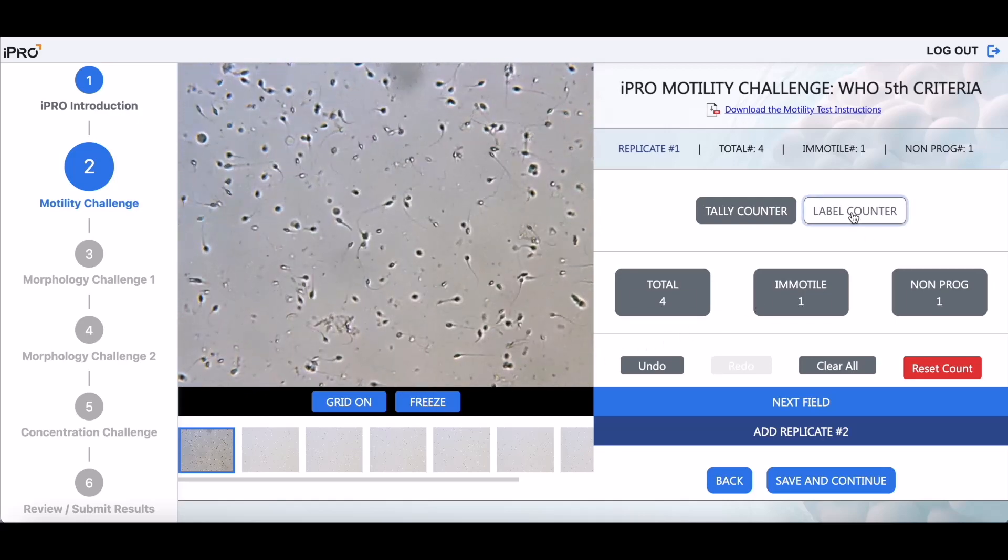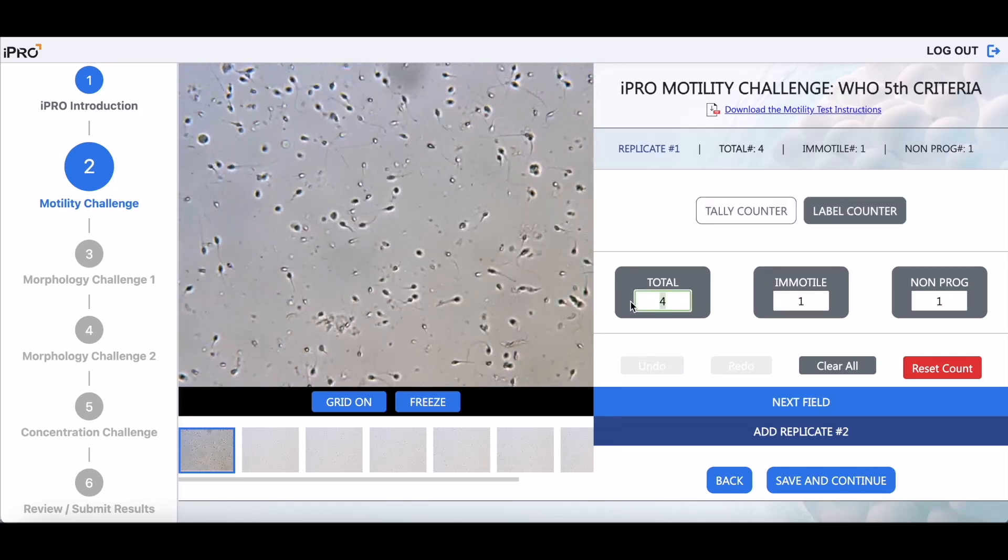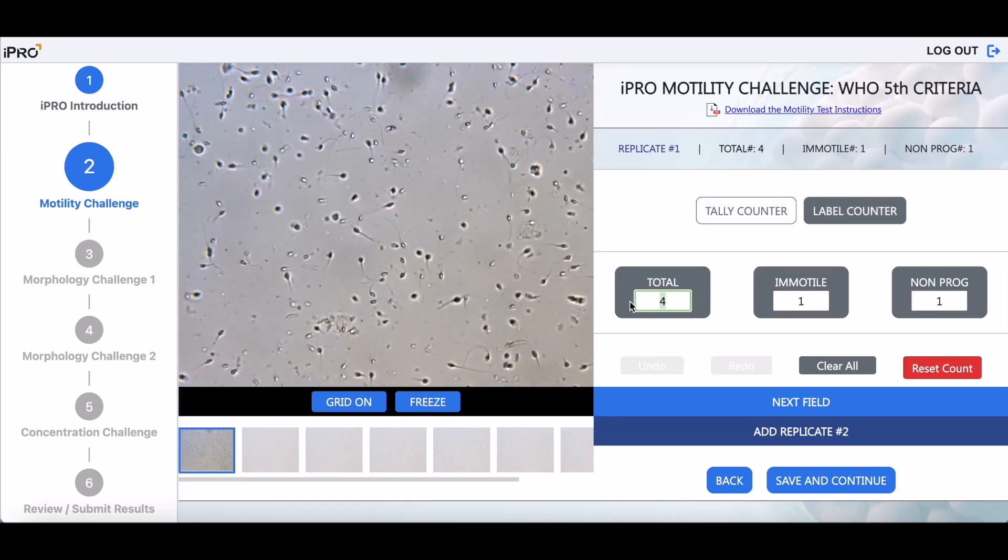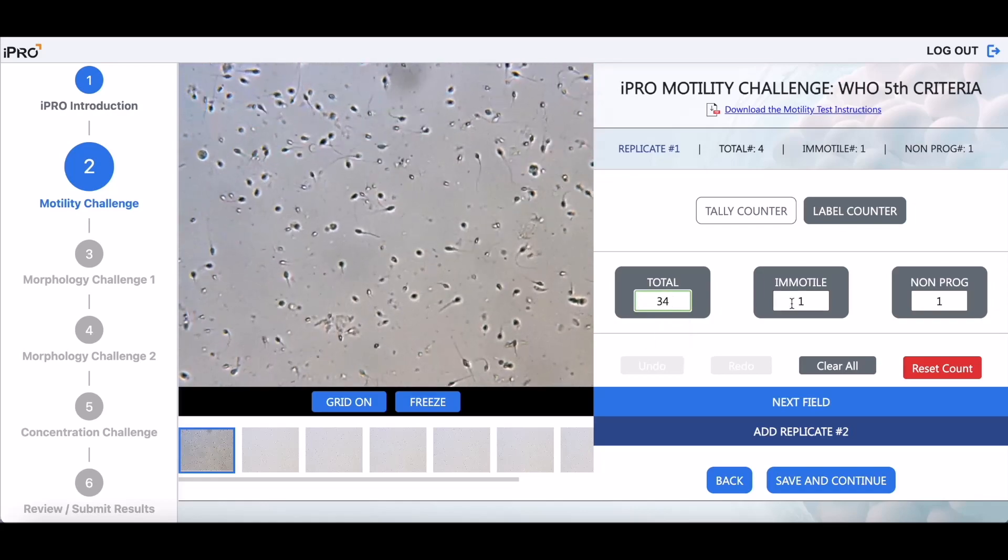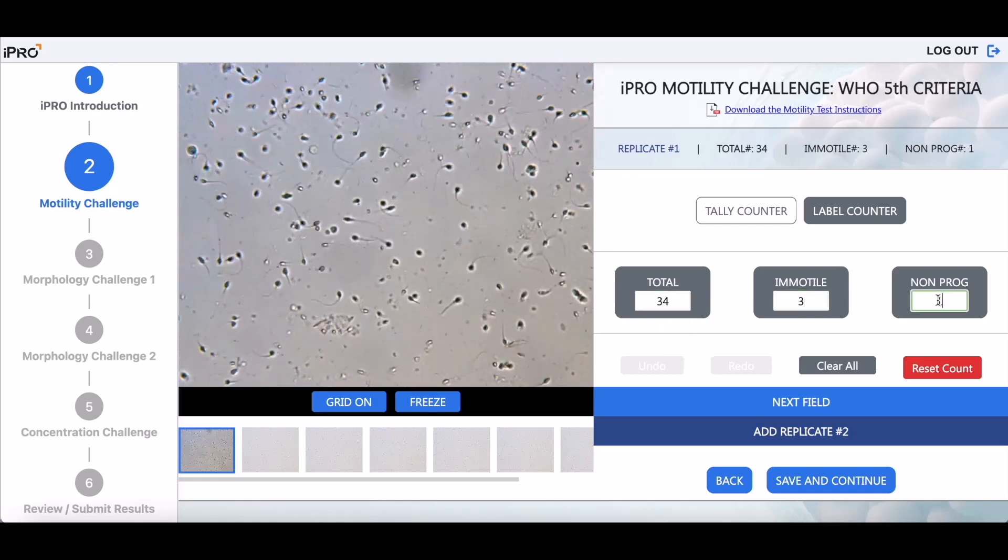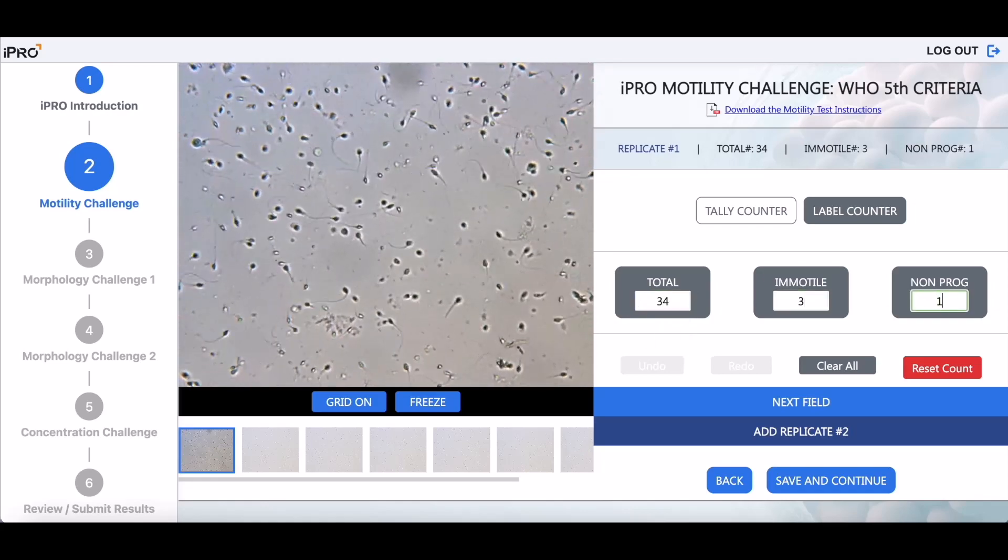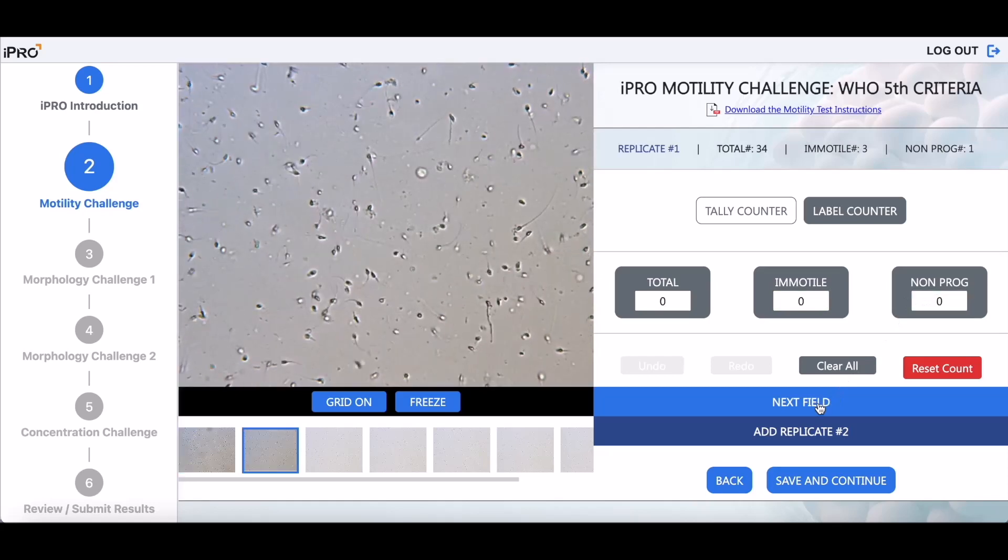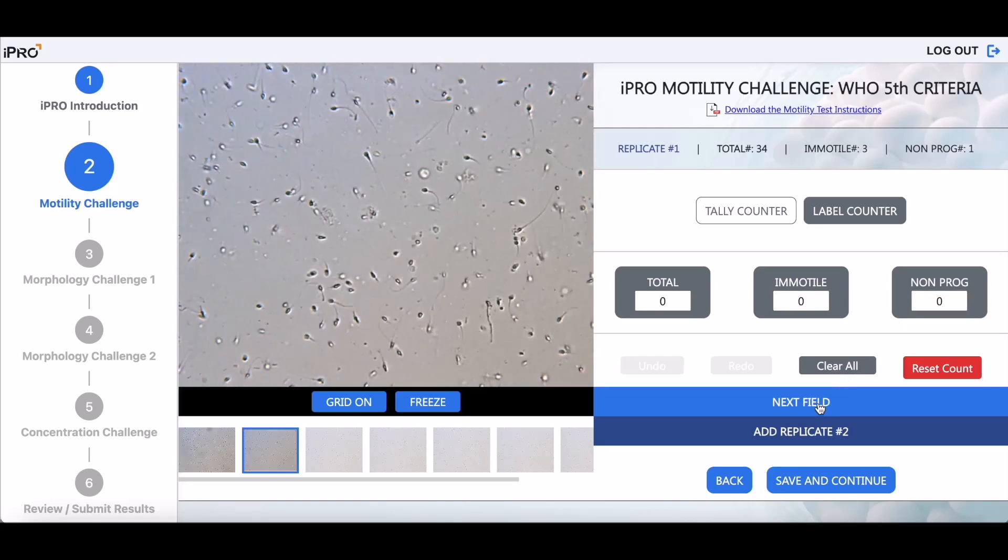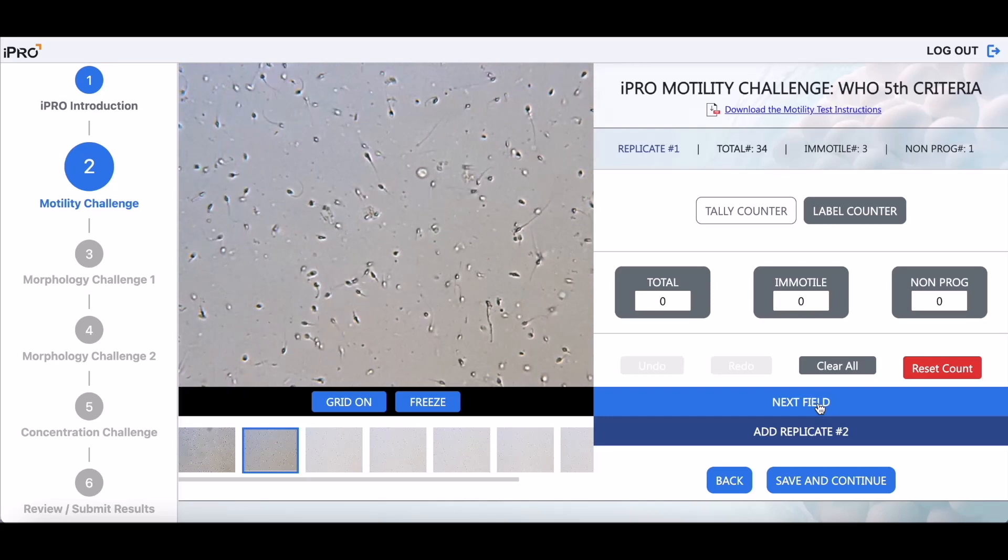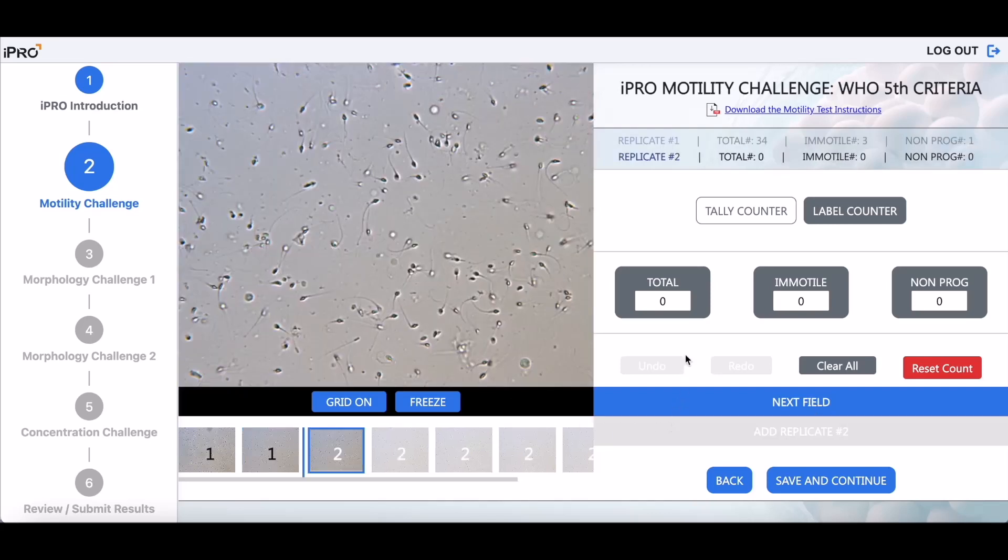Alternately, use the iPRO label counter to type in total values. Click Next Field when you have completed counting. A new field of view will then be displayed for your next count.